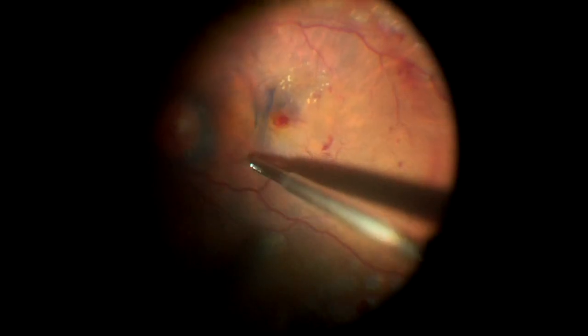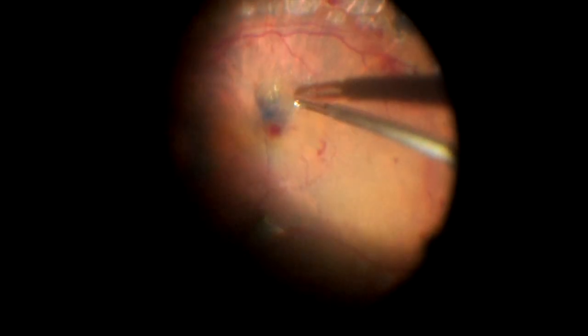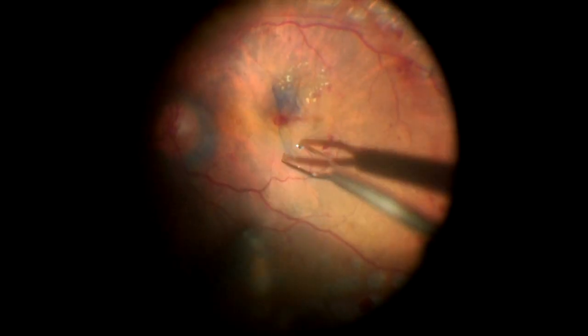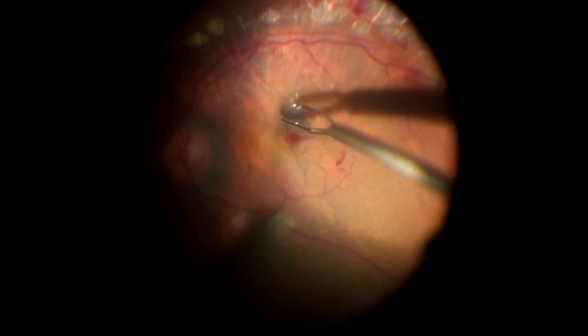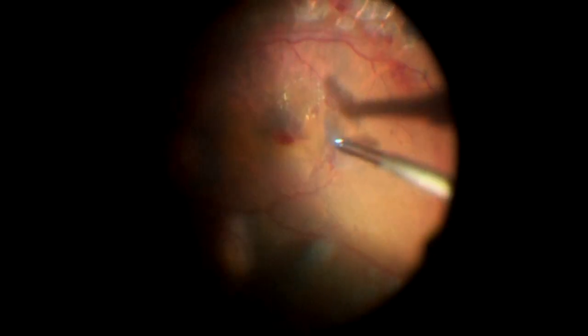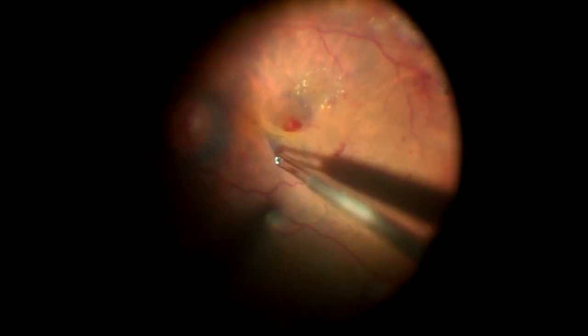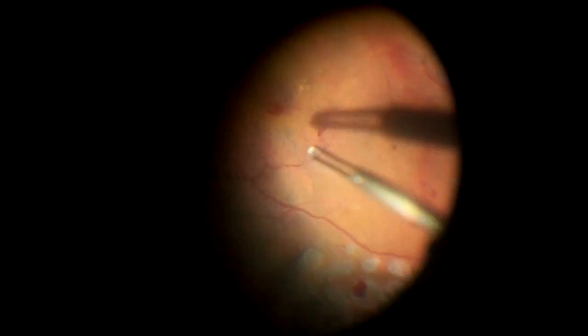So immediately after the stain is done, you are taking further hyaloid. That is basically because there is already a vitreoschisis in place. So this is a very important thing in proliferative diabetic retinopathy, where vitreous may be in two layers. And now you are having the actual ILM peeling.